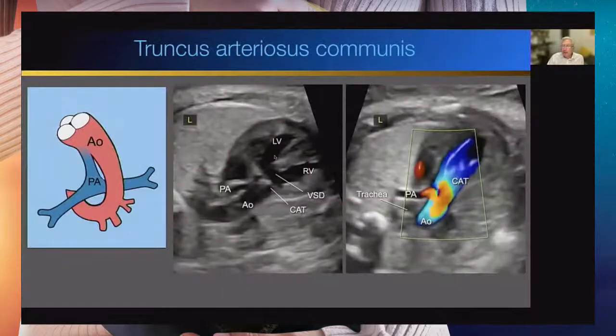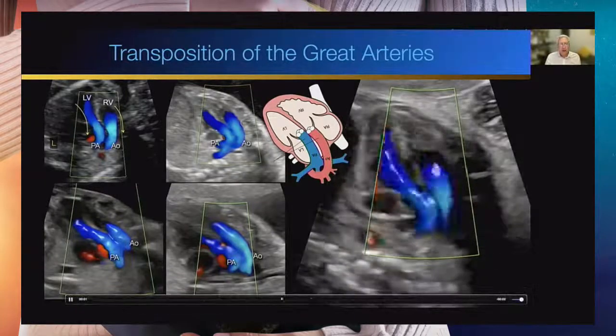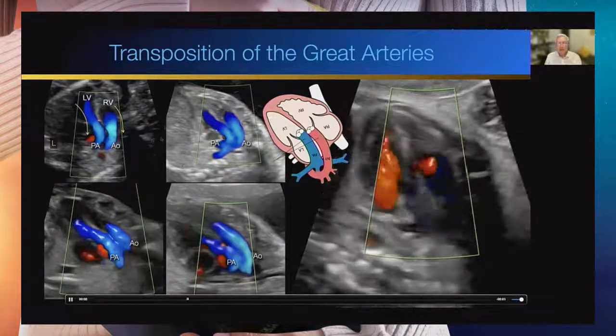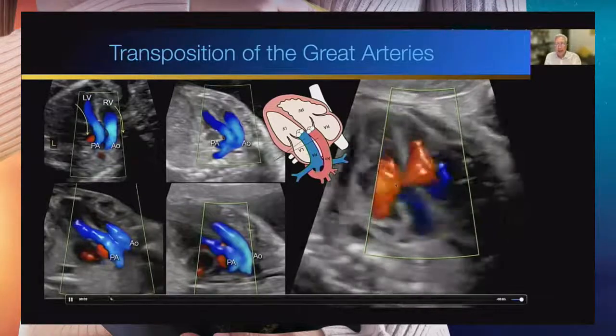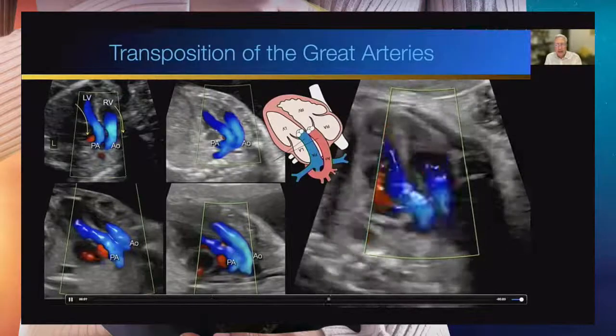Another condition, when you think there is an aorta, what you assume to be the aorta, which is then a common arterial trunk for many, is the transposition of the great arteries. In this group, you will be using color Doppler to demonstrate the parallel course of the vessels, which is not always very easy to discover on grayscale.